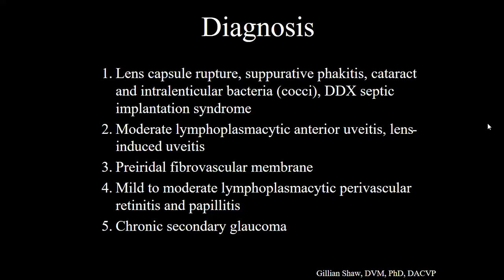The clinician did say that the dog felt much better after she had been enucleated, so that's happy news for this patient. Anyway, my diagnosis here is lens capsule rupture, suppurative phakitis, cataract, and intralenticular bacteria, cocci. And this is what we call septic implantation syndrome. There is also a moderate lymphoplasmacytic anterior uveitis, which I attributed to a lens-induced uveitis associated with lens degeneration.